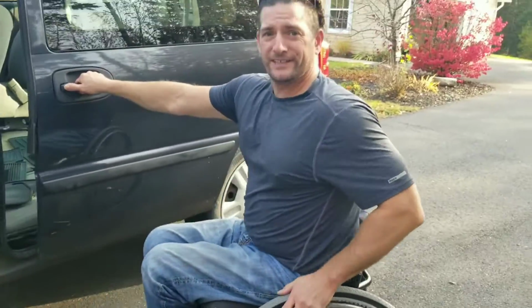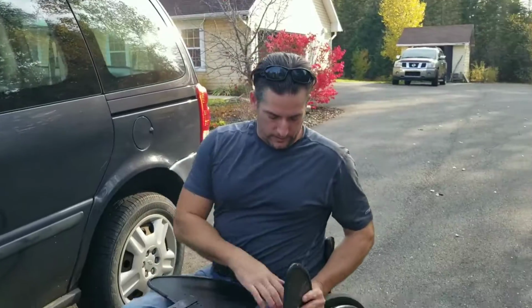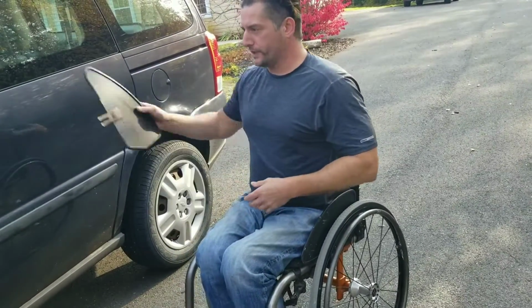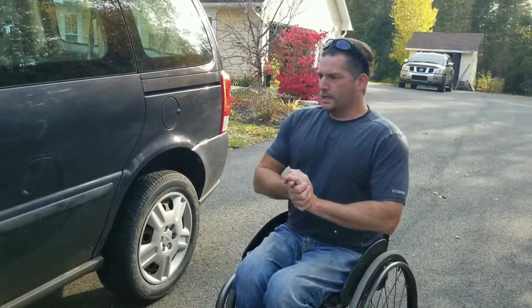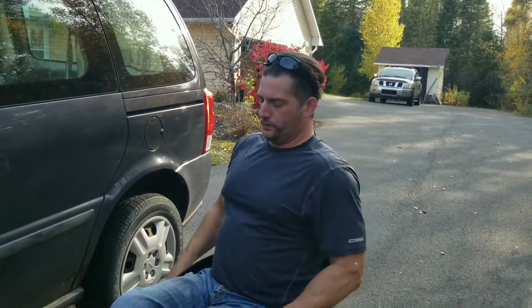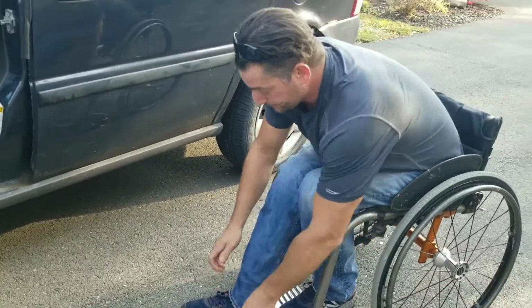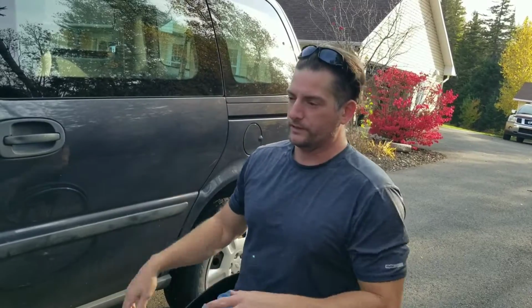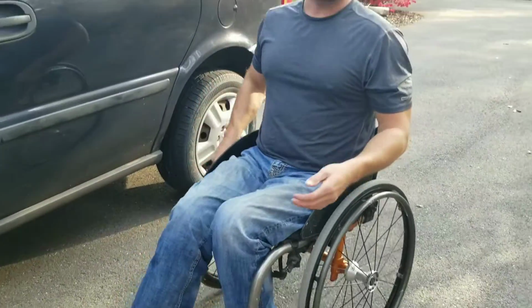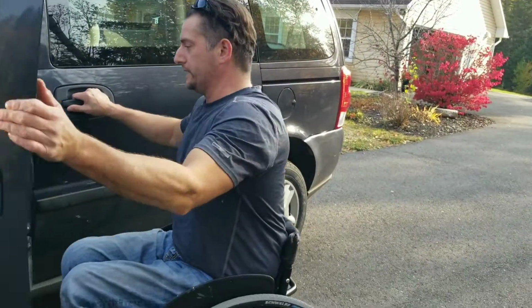It's been a long time since I did that. Wow. So now, that's what I used to do. Probably the first year of my injury. That's how I'd transfer in and out of my old Jeep. So then when I started getting strength in my legs, and with the use of AFOs from the knees down, both feet, both legs, instead of always bringing my chair across, I found that inconvenient, and it was really making a mess of the vehicle because of the grease, the snow, and the sand, and the salt from wintertime. I started to put it in the back, the hatchback of the Jeep.